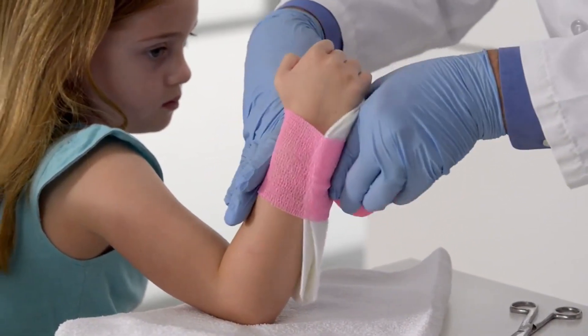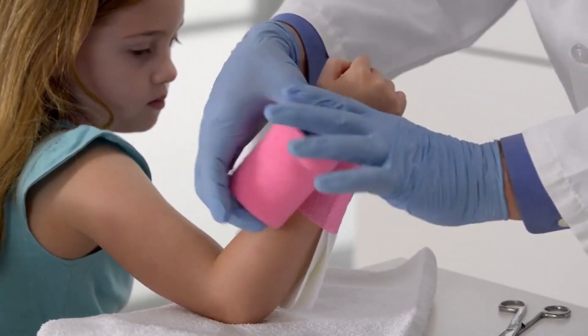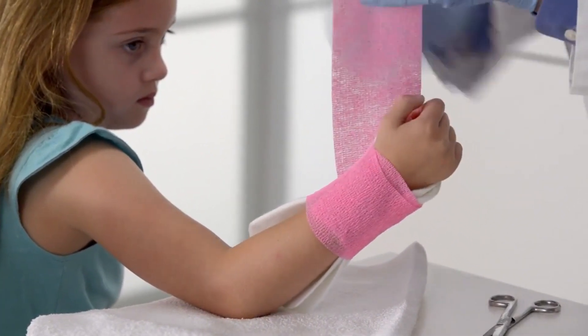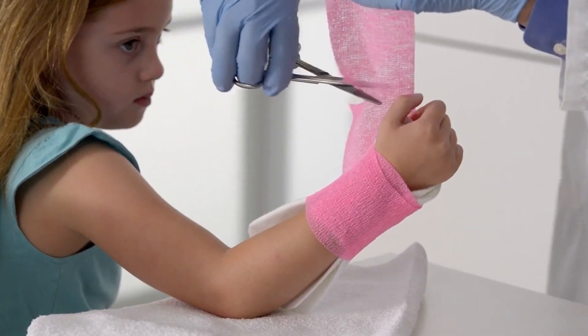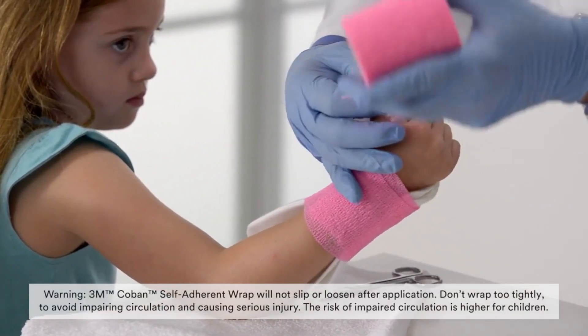Now start overwrapping the splint using 3M Co-Band self-adherent wrap. Alternatives could be bias cut stockinette or an ACE elastic bandage. Begin wrapping at the wrist, working up toward the distal palmar crease.